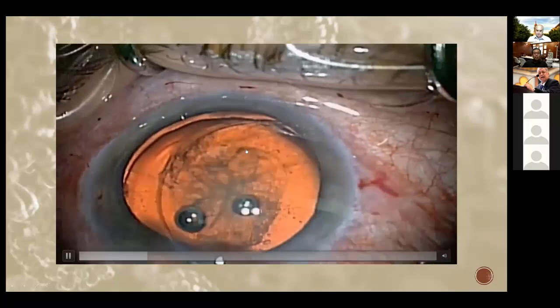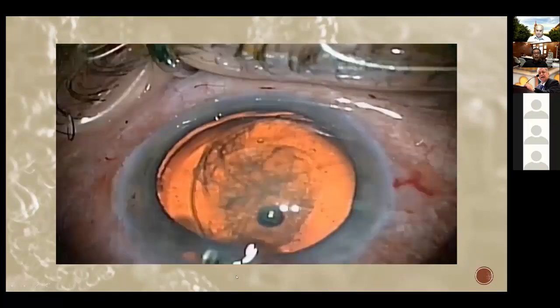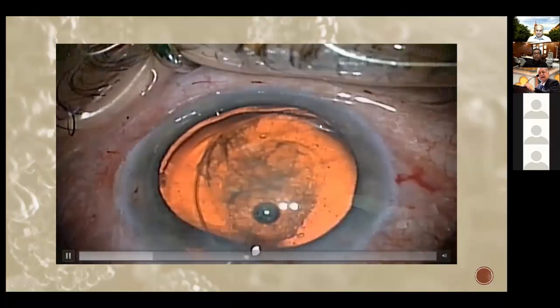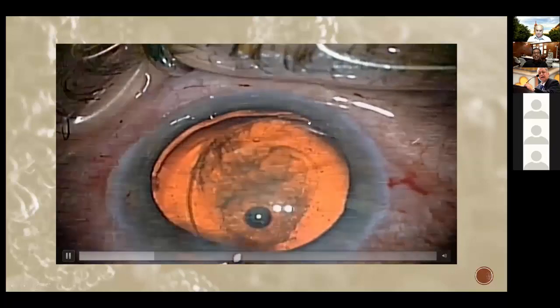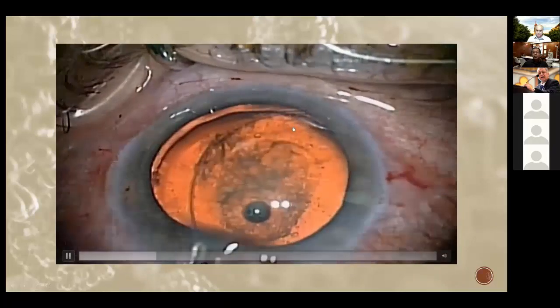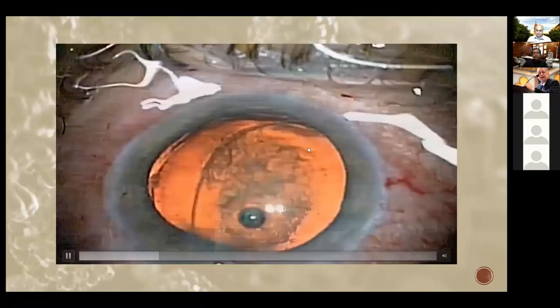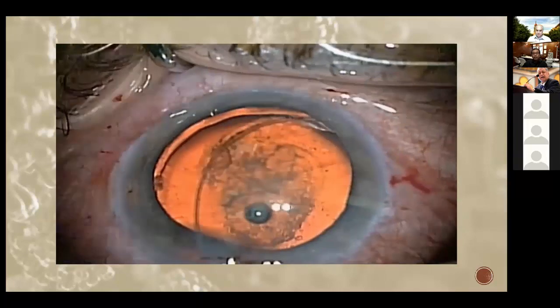So as I push slowly, progressively, feeding one hand to the other, like shaking hands, do you see this empty space? It tells you that this capsular tension ring is outside the cortical material, which is a very good thing. This is something that you want, so you don't have a problem with the cortical material when you are doing the irrigation aspiration, okay?